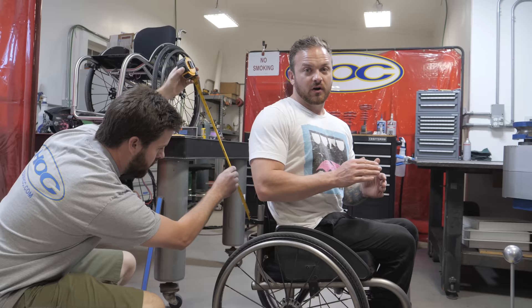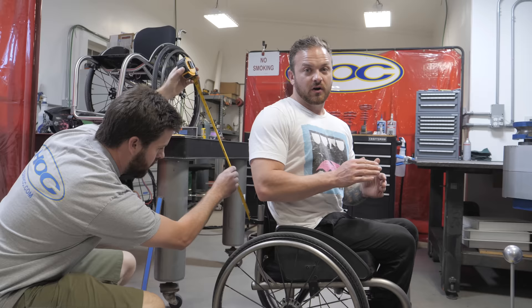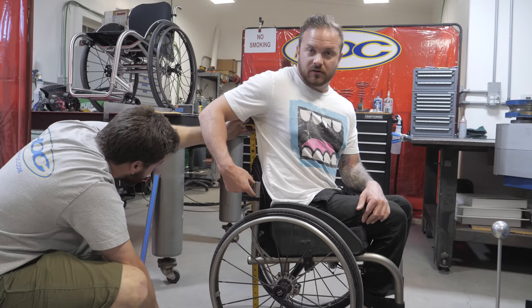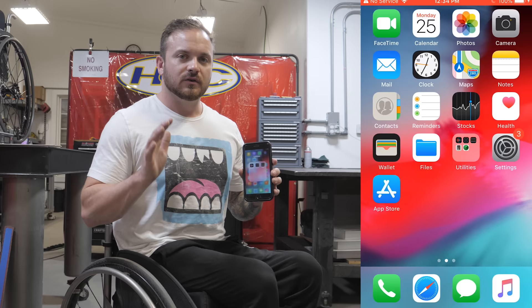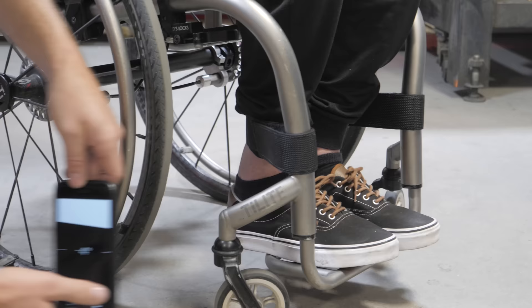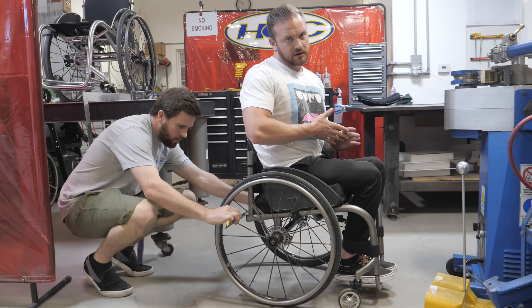He's now measuring how far the top of my backrest is from the ground so they can get the perfect measurement for the back posts — so there's not extra chunks of metal just hanging out ready to poke into your sides. If you're measuring at home, iPhone has a really cool app called Measure. You can jump to the bottom right and it automatically brings a level up for you. The measurement we're taking now is the width of my chair.